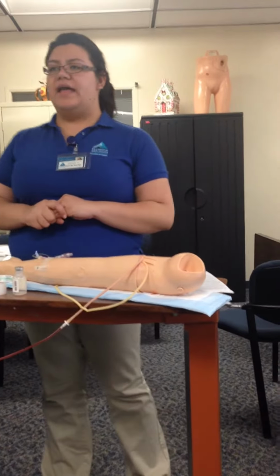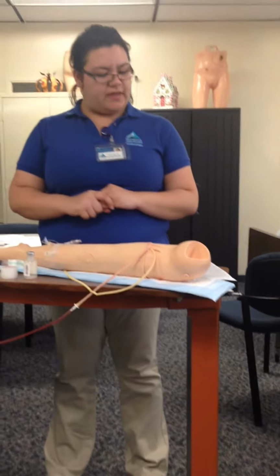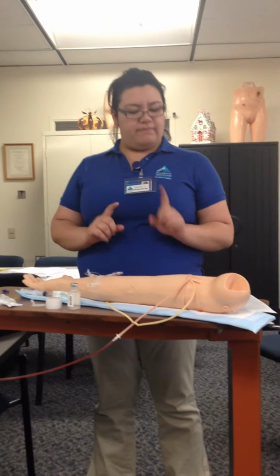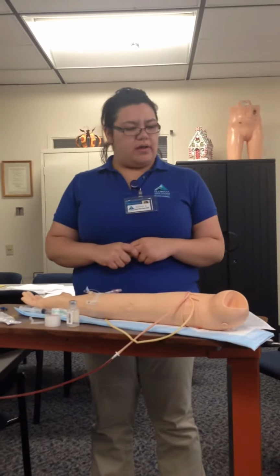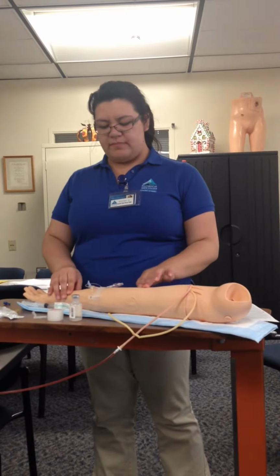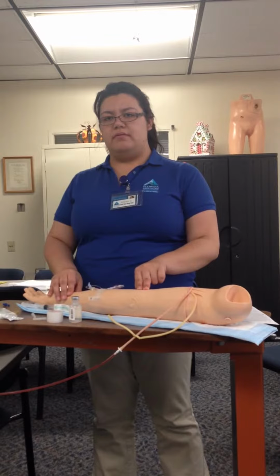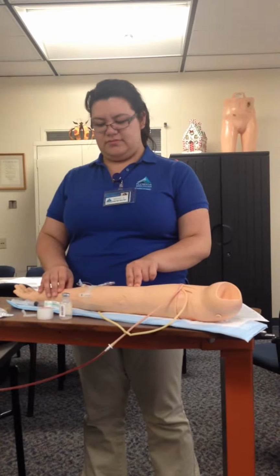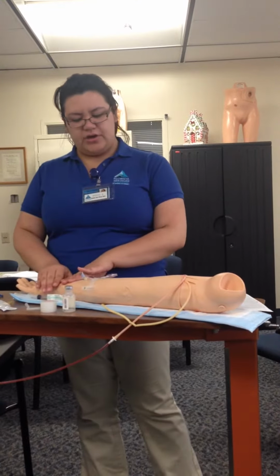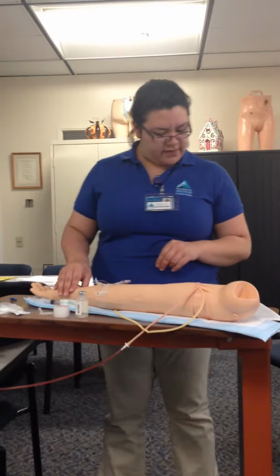I'm going to identify the client. I'm going to explain the procedure, that the doctor has ordered an IV med via the Minibag. I'm going to double check with the patient their name. Can you verify your name for me and your date of birth? John Jones, 2222. Okay, very good, Mr. Jones. Matches the wristband. I've seen in your chart that you don't have any allergies. Is this correct? That is correct. Okay, very good.